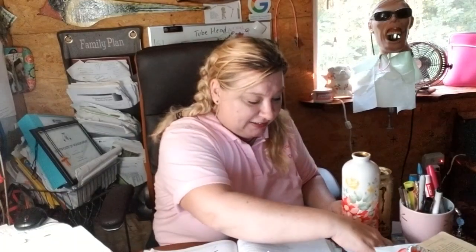Now, I did cut this out to put this in my mouth just to show you guys, okay? This is an occlusal film. I believe that's size 4, occlusal film. And then you're going to fold it, okay? You're going to tell them they're going to feel like a duck. Because when you have just one film, it's about this size, you're going to fold it. And then you're going to put the part that opens up on the outside, to make them feel like a duck. And then you're going to go like this. And you're going to tell them, bite down like a cracker. And then you're going to take a picture like this. And raise the nose.